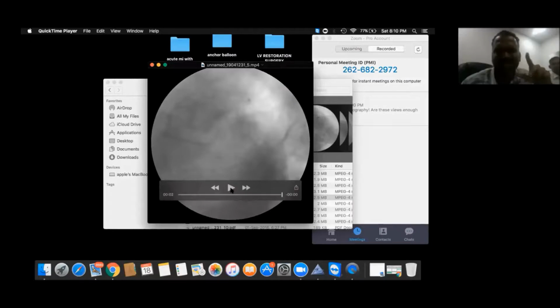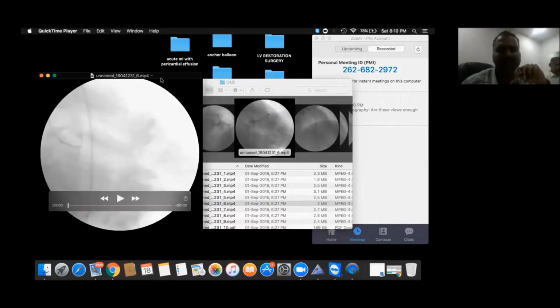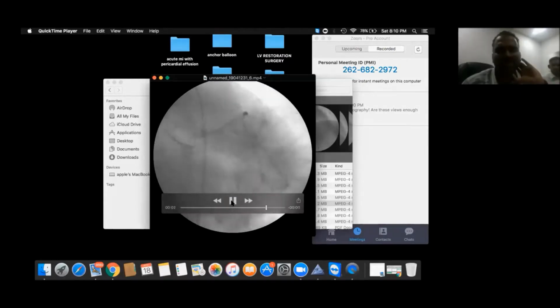So in this case, not being able to enter the coronary is one sign of disease. Second, there is an irregular opacification, or discordance in opacification, from distal to the lesion site or ostium site. That is another thing which really says there could be something. And see this view. You're not able to see anything.